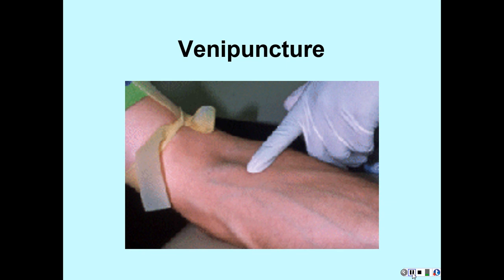If you've got a really good vein in there, then you can use the vacutainers, and I'll show you that. But you just have to be careful. But yes, it can be done. And in fact, your patients like it better if you can do it that way.